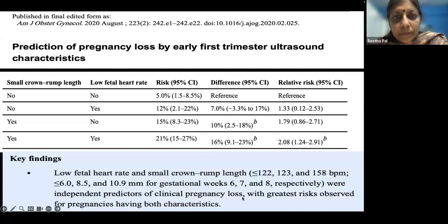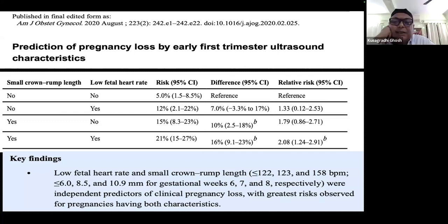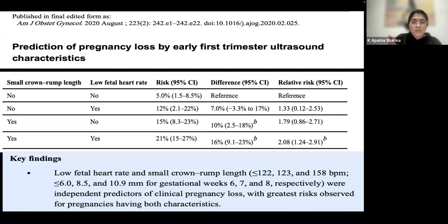When it first starts, it is very slow, around 80 to 90. That's why some of the articles have actually mentioned 90. So yes, that's a gray zone, across 100, 110. But I thought this is the latest. So maybe we really have to see.